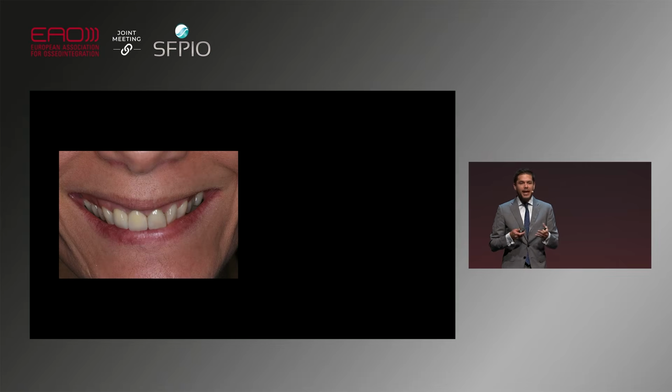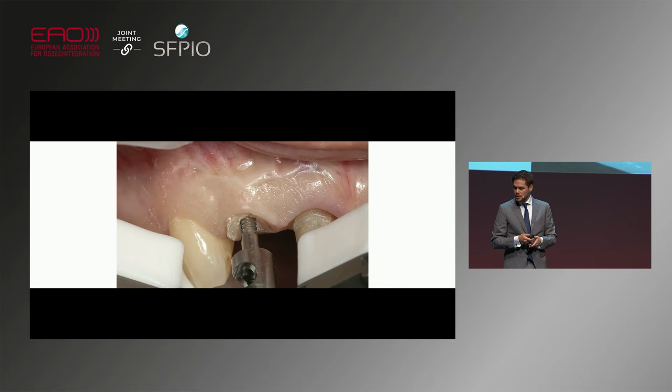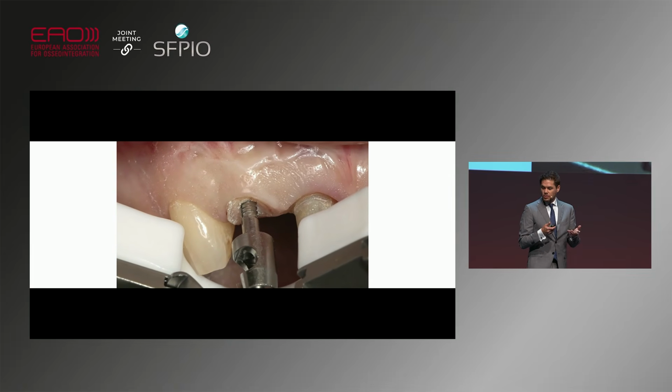The situation is further made complex by the fact that she really displayed the region of this lateral. And I have to tell you that there is no way I'm going to place an immediate implant here, and there is no way I'm extracting this tooth and leaving this tooth and this tissue unsupported. When I extract the tooth, I want to support the tissues, because I know if I support the tissues, I'm going to have less chance of these tissues collapsing. It's the concept of not letting everything collapse and then playing the catch-up game to recuperate it, but trying to stabilize it from the beginning to lose less than what I would if I wouldn't do anything. So obviously, it's important to perform a careful extraction.